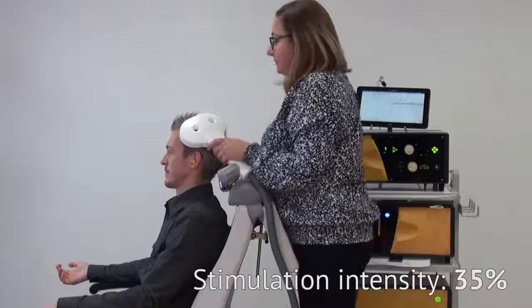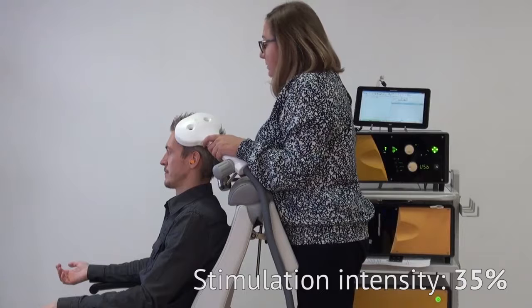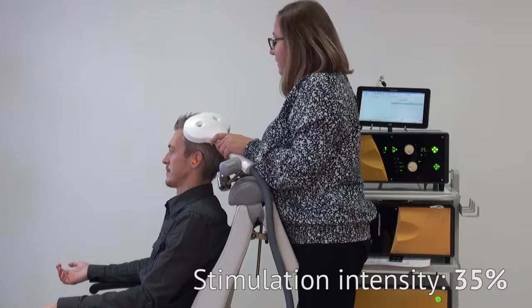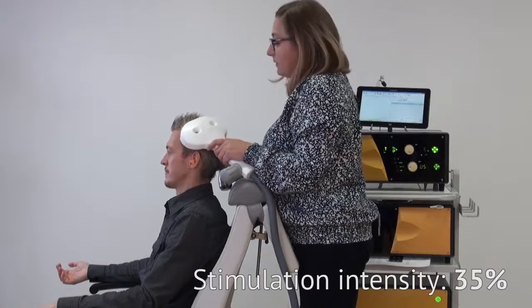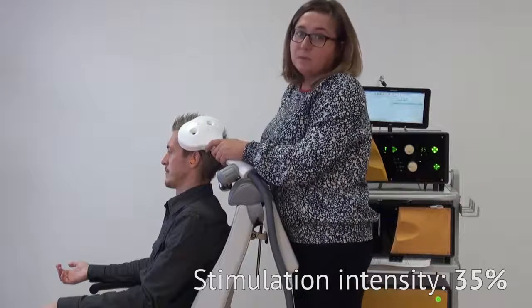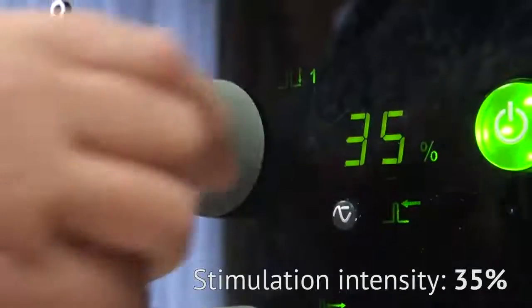And repeat. 1 pulse, observe, 1 movement, stop, pulse, observe. If there is no visible muscle contraction, increase the amplitude by 5%.